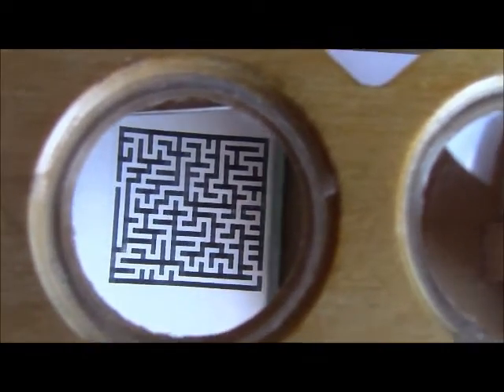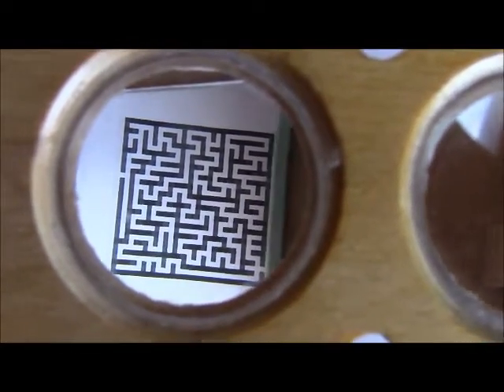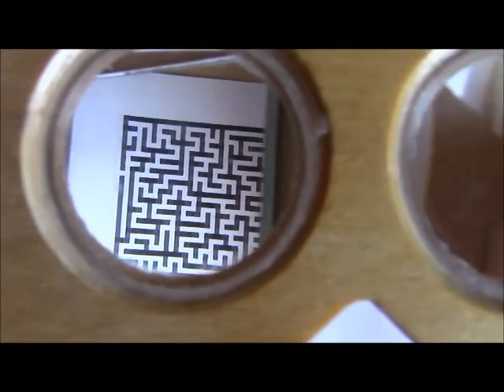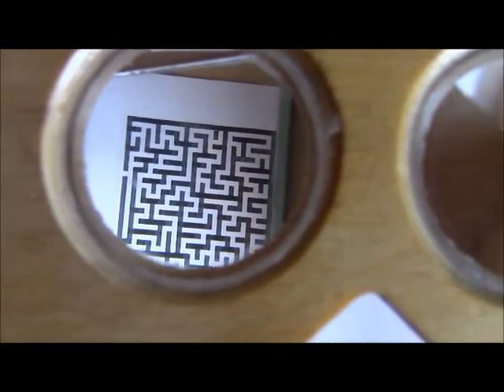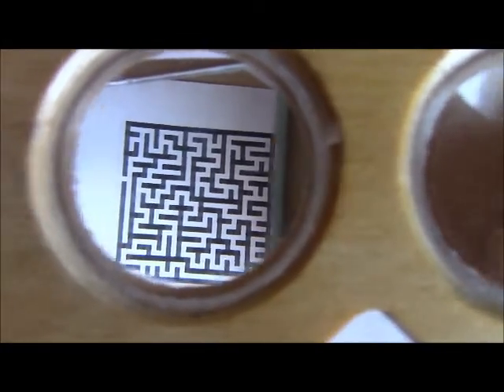But right now that I'm getting better, I can actually refixate my eyes without completely losing the relative position of both images. So that's why at this point I can solve a maze like that.